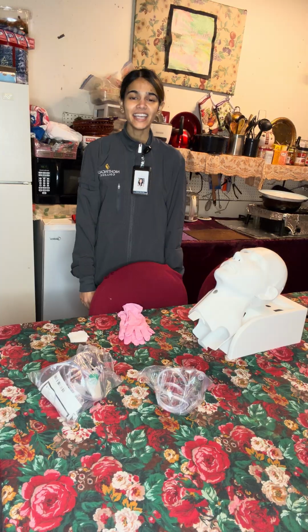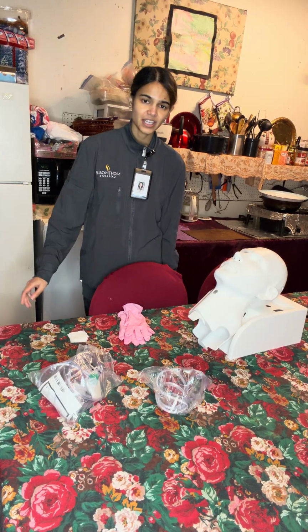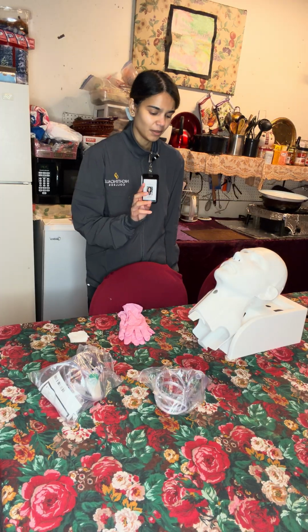My name is Pranita and today I'll be demonstrating the oxygen administration skills video. For this video, you'll need a simple mask, a nasal cannula, gauze, gloves, and a model head.